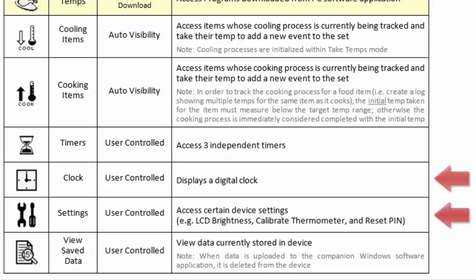The Settings icon gives you the ability to adjust the handheld's screen brightness and contrast, toggle Quick Help messages on or off, walk a user through resetting the probe's calibration on the device, and reset a user's 4-digit security pin.